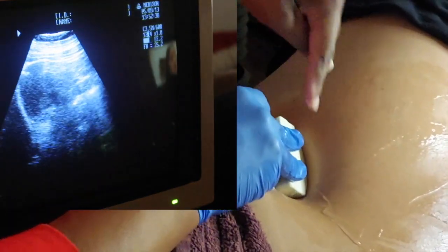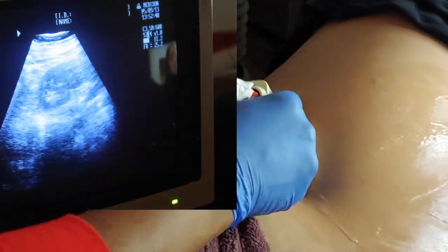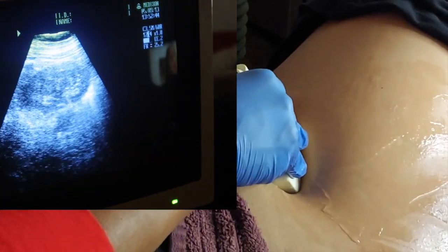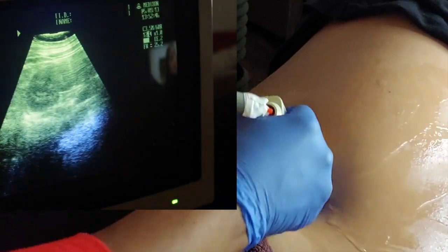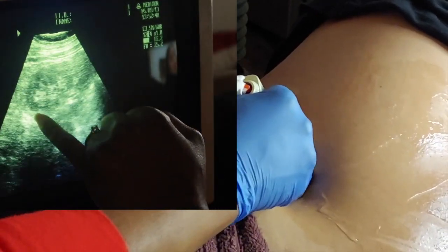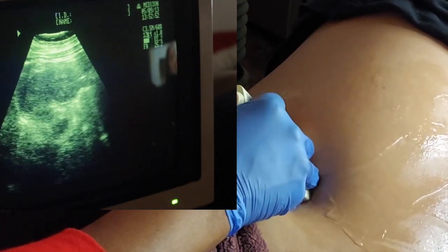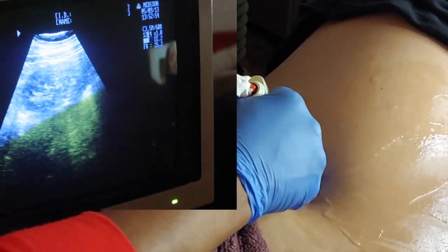Just like that. I don't know if you can tell the pressure I'm applying, but I'm pointing up and it's giving me a beautiful sagittal view of the kidney. When you're scanning, you want to look at the edges of the kidney — make sure they're smooth and make sure that there's nothing coming off the edge.